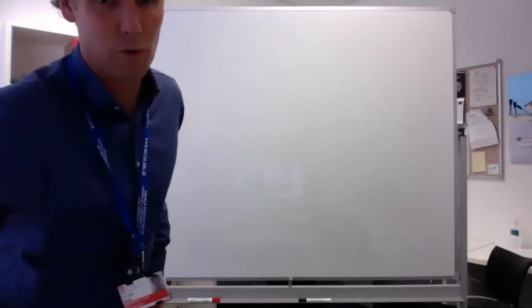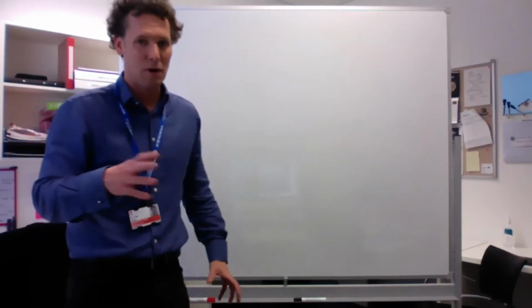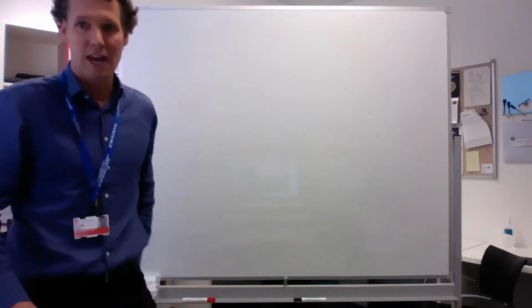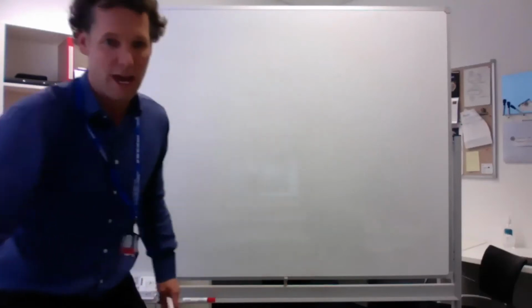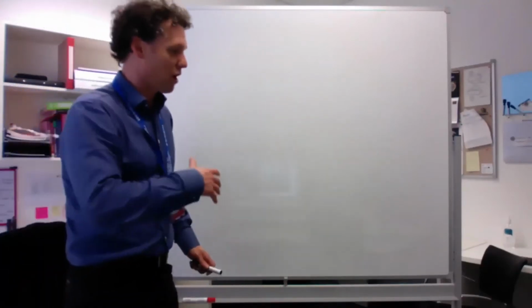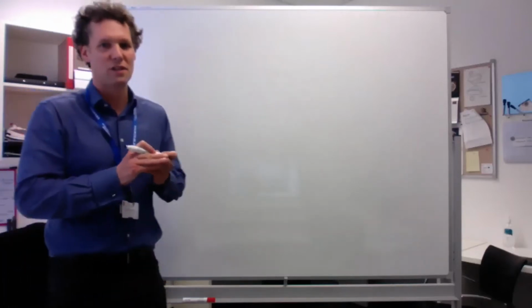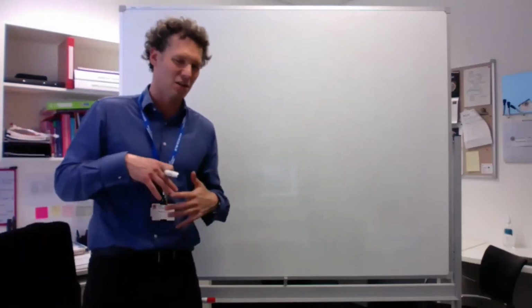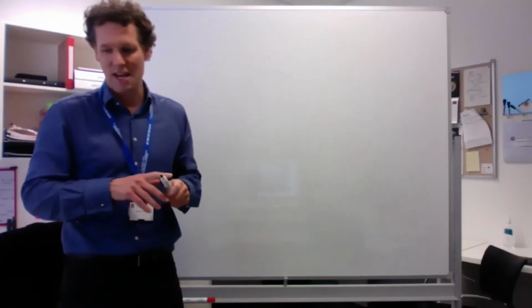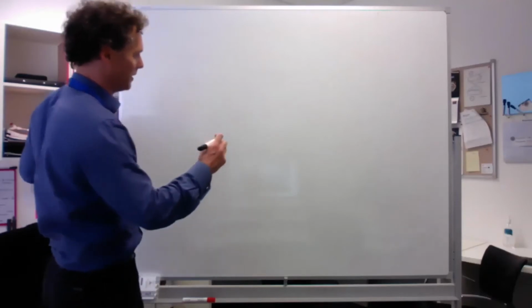Hi everyone. We'll go through echo in CPR as well as ischemic heart disease today. It'll be about 45 minutes. So let's start off with the exam question, which is normally along the lines of discuss your use of echo, or it might say discuss use of ultrasound in someone with a non-traumatic cardiac arrest.